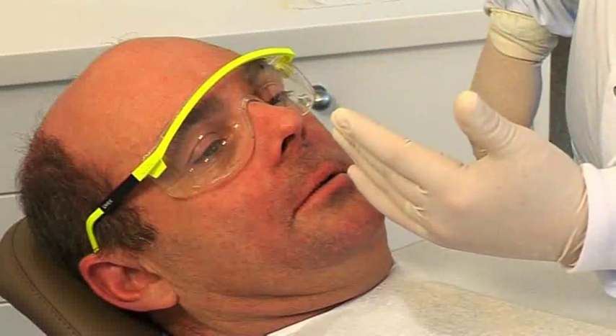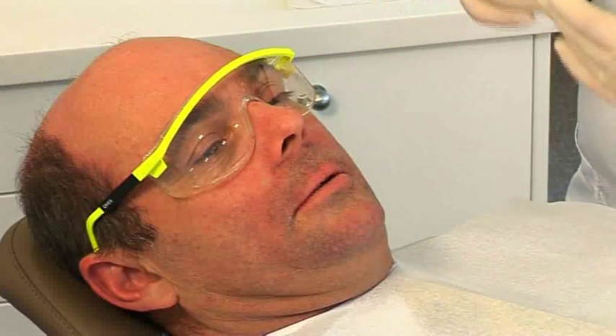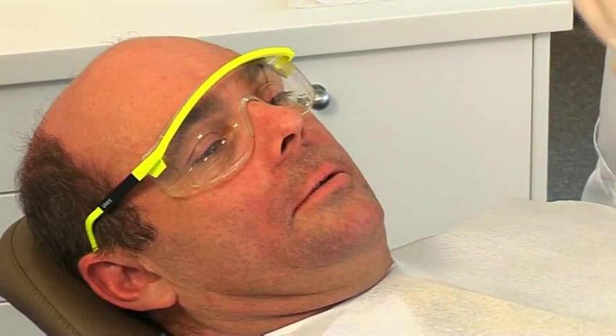The dental midline does not necessarily have to be in line with the skeletal midline. In Simon's case, we're lucky we've got dental and skeletal midlines that are congruent. So let's try some pre-training now.